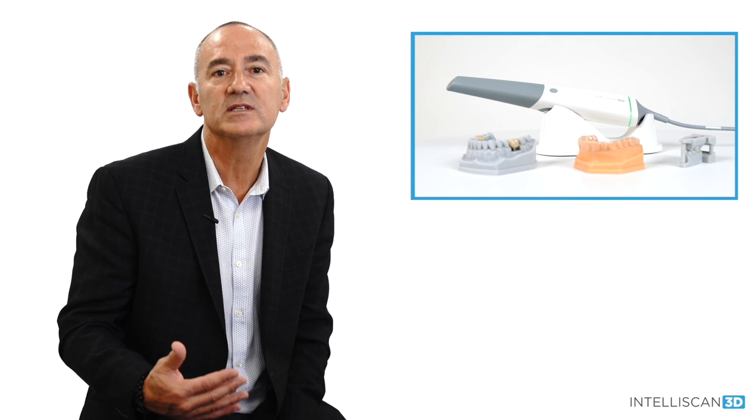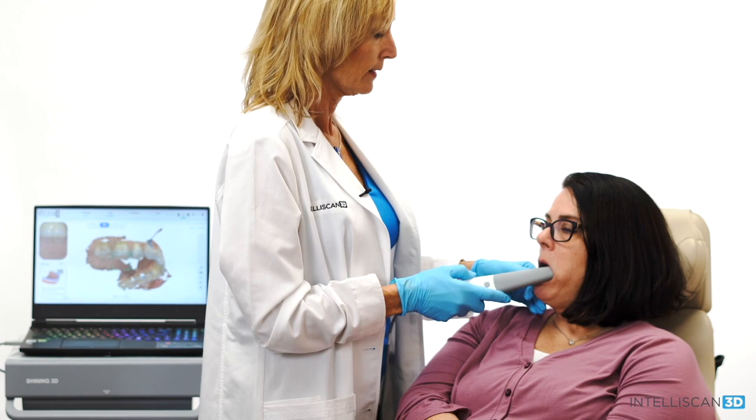I've been utilizing intraoral scanning in my practices for over five years now. In that time, I've used many different scanners and have seen many different scanners enter the market. Some are still around and many are not, and I believe the reason for that is that not all scanners are created equal — they're not all the same.